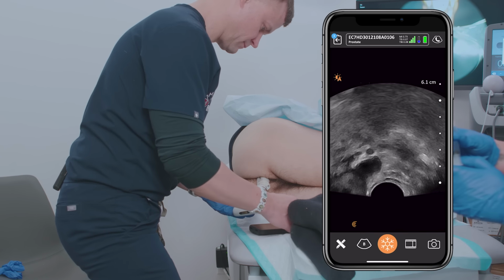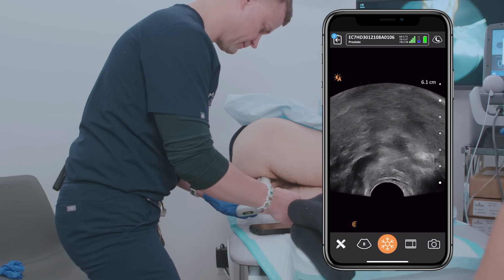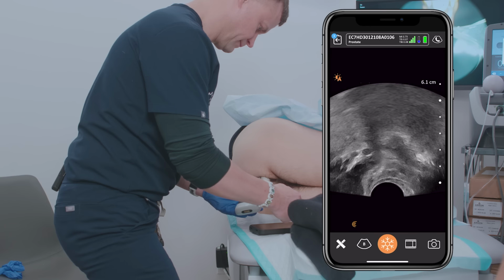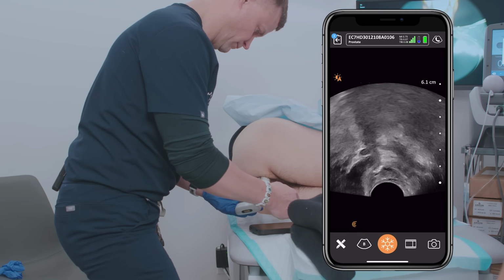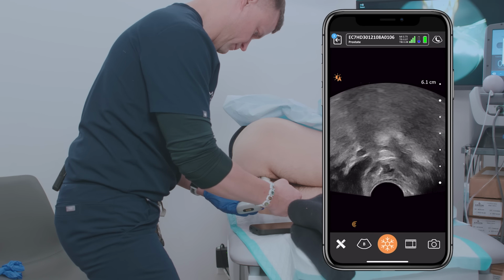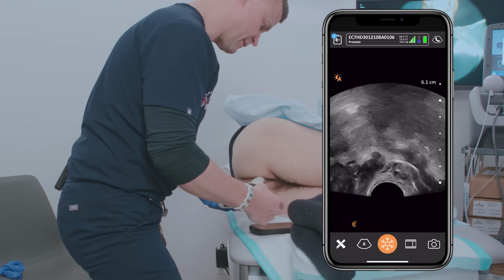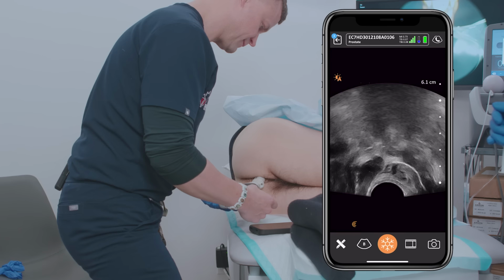So at this point, delivering more anesthesia under the seminal vesicle to ensure an optimal blockade for the Rezum BPH procedure. So clearly the delivery and the anatomic precision of the urological and vascular structures are unprecedented.